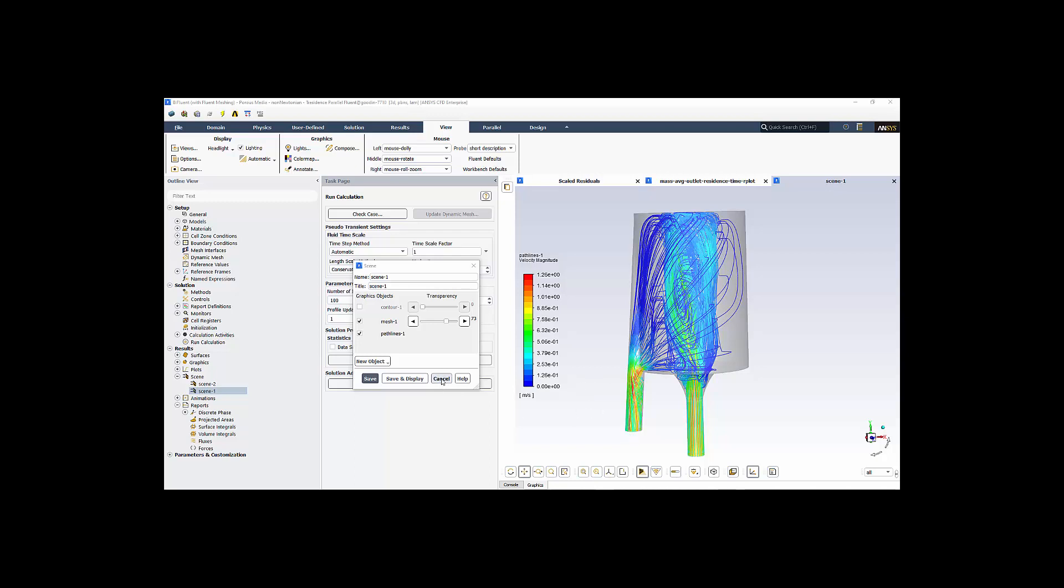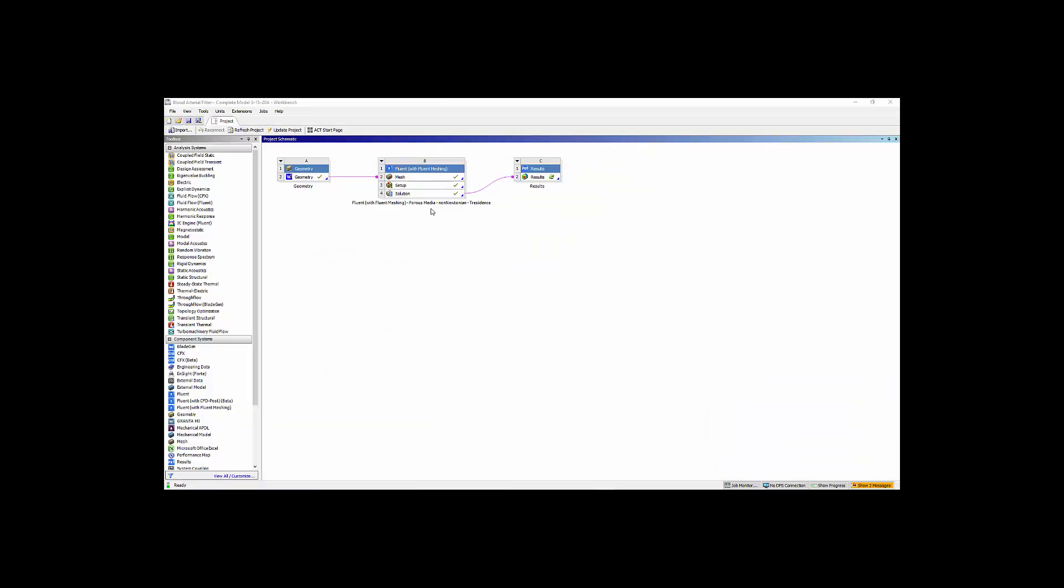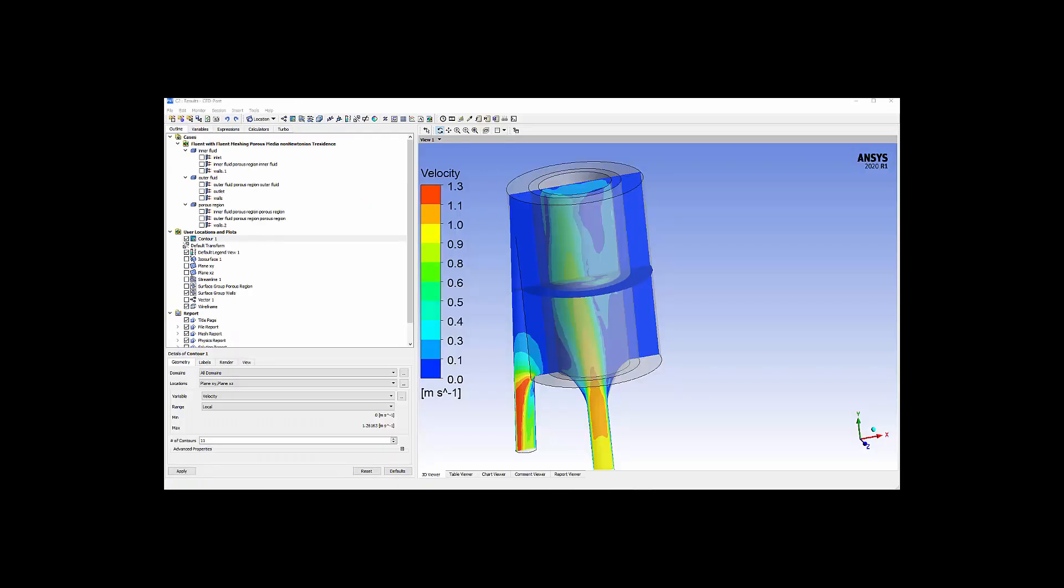But I'm also going to open up CFD Post, another way to visualize our results. So we close out Fluent. We come back up and we just double click on results to open up the CFD Post component. This is CFD Post where we can visualize the CFD results and get insight into how to improve our filter design.